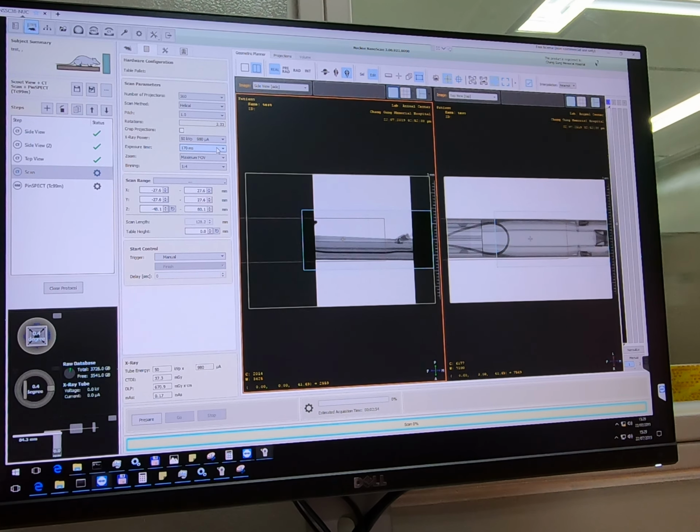Actually, for just a simple general scan, what you mentioned, I think that the middle energy would be better. I don't actually know, so I cannot give you a real indication for the low energy. Maybe not for the vascular scan, but for the soft tissue contrast agent scan, maybe the lower energy would be better, but I cannot really tell you a real indication of that.